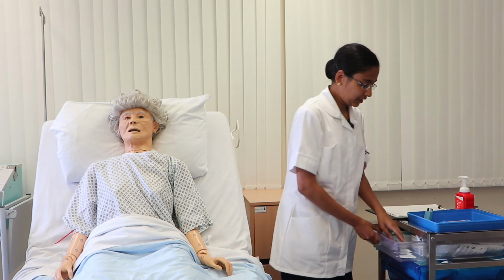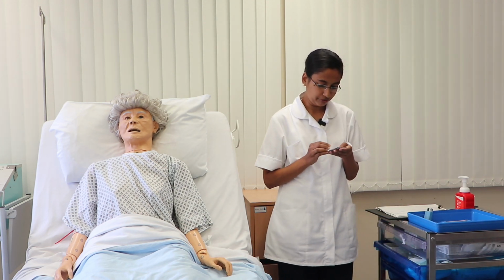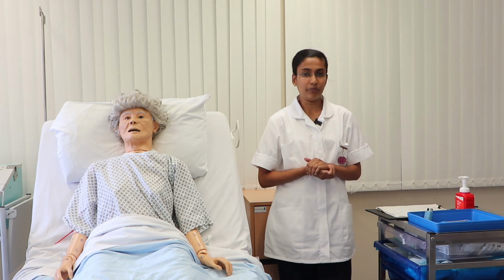And next I need 2 alcohol wipes, that are clean, dry and intact, within the expiry date of 2024. It is safe for me to use. Now I am ready with my materials. I will approach my patient now.